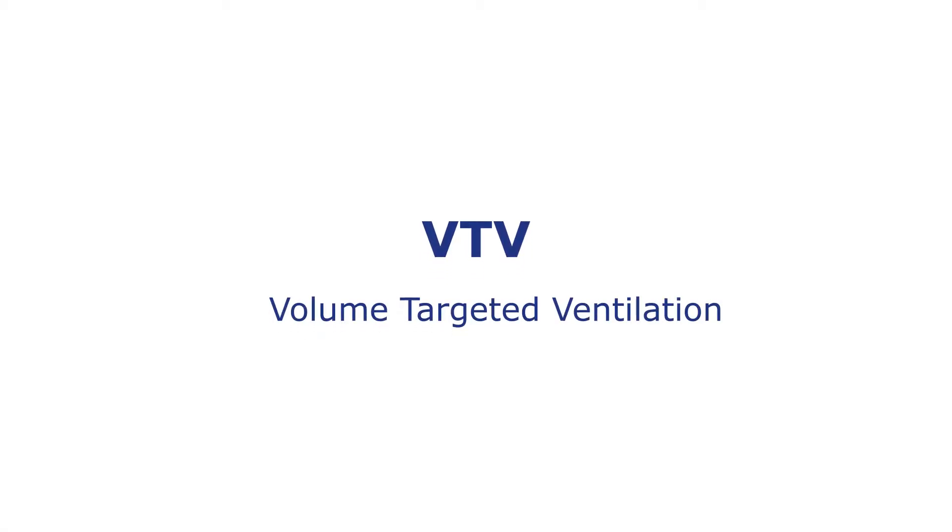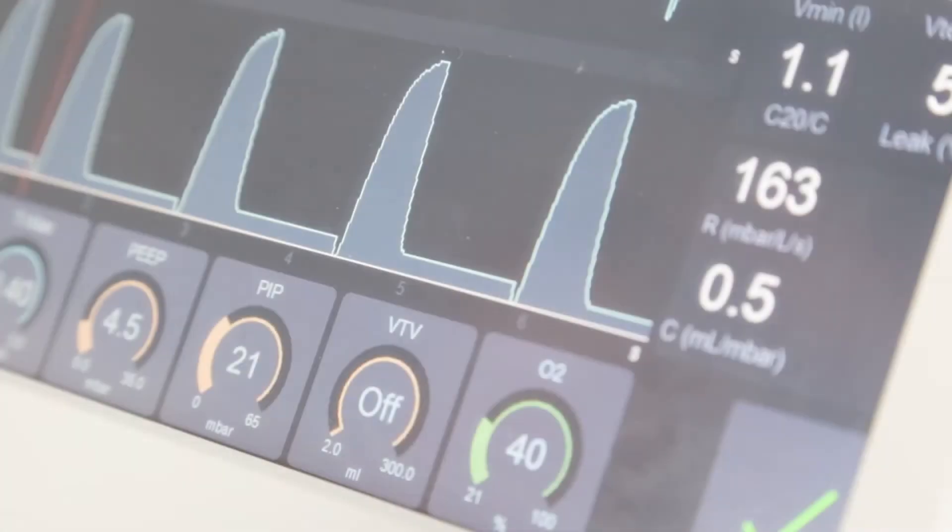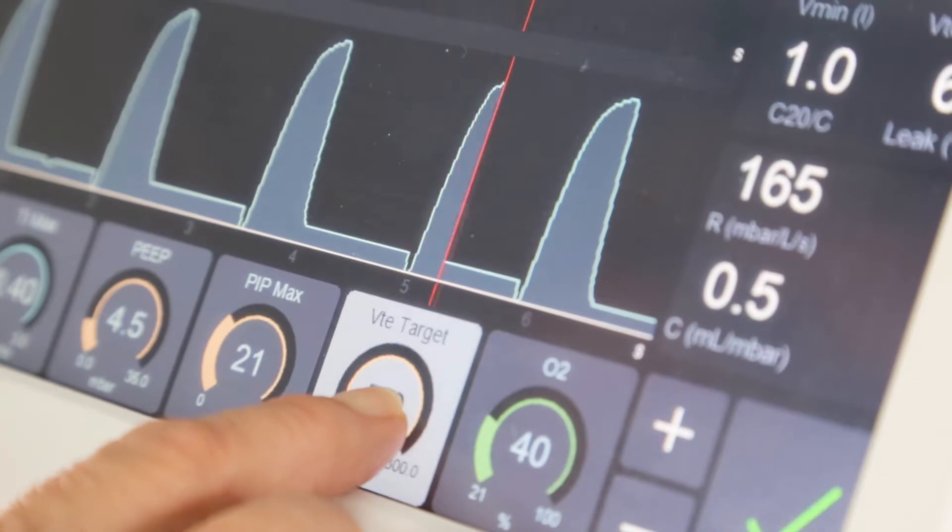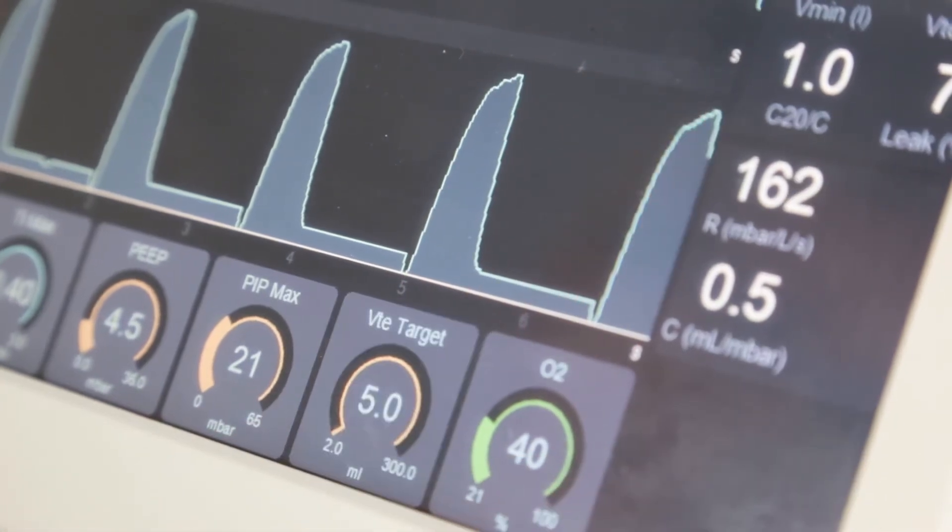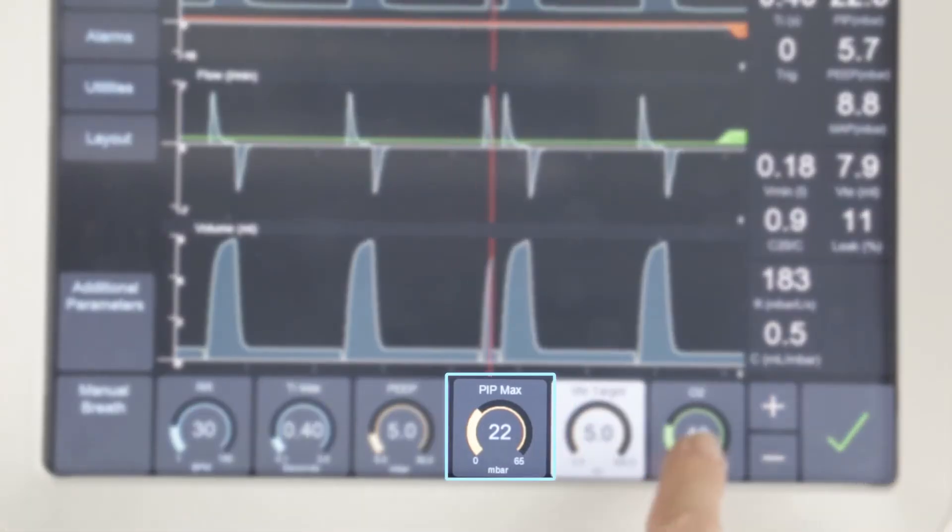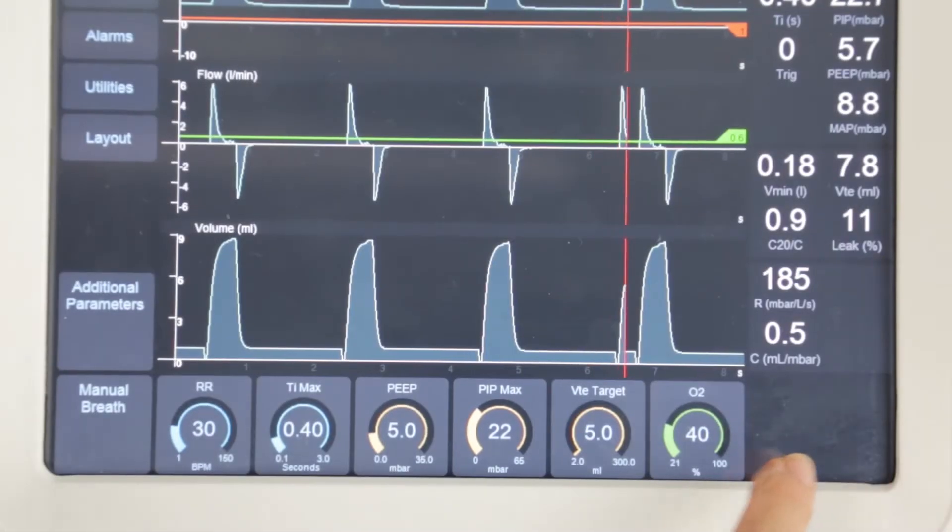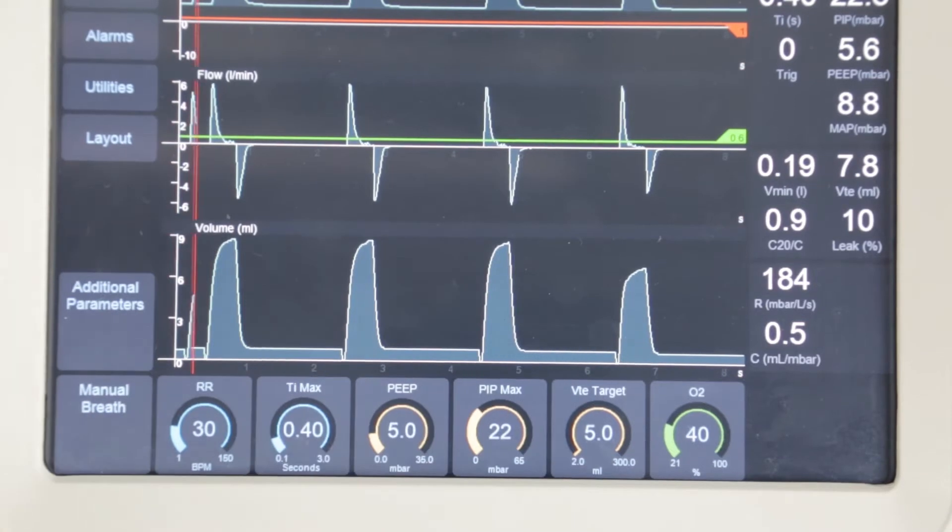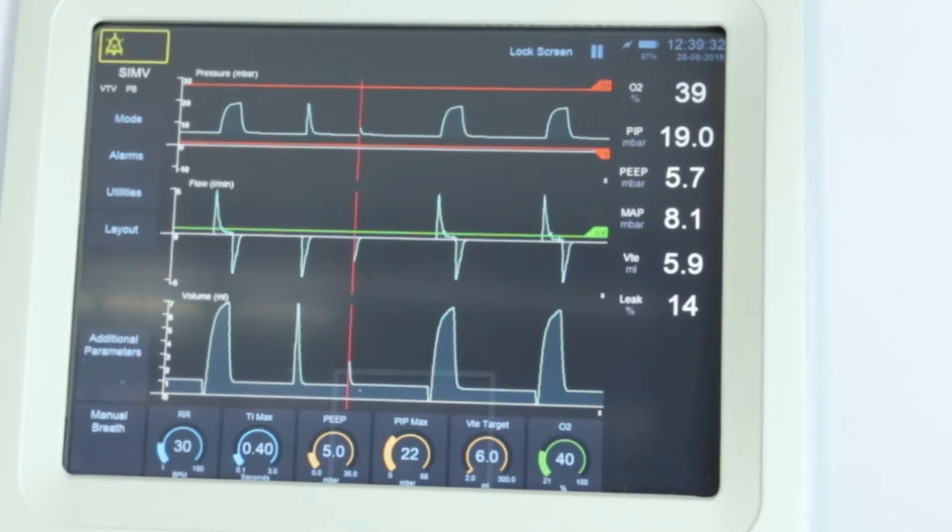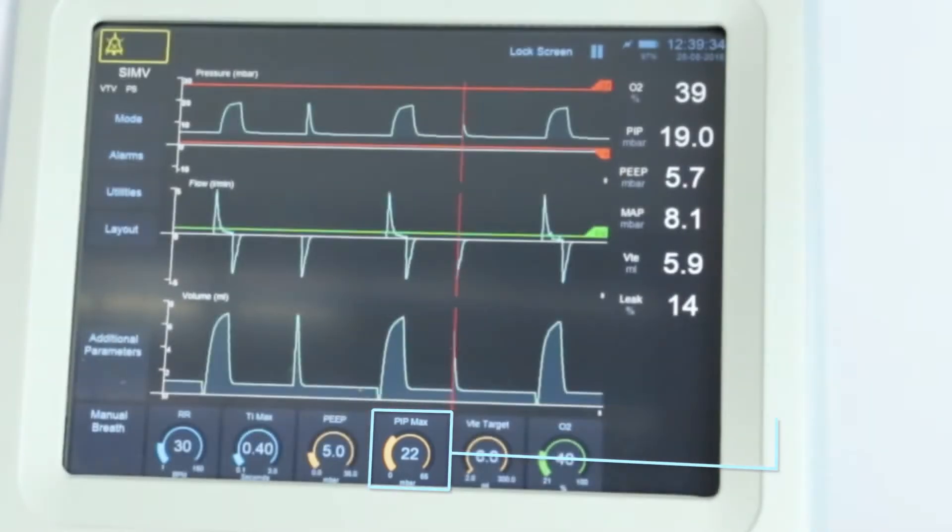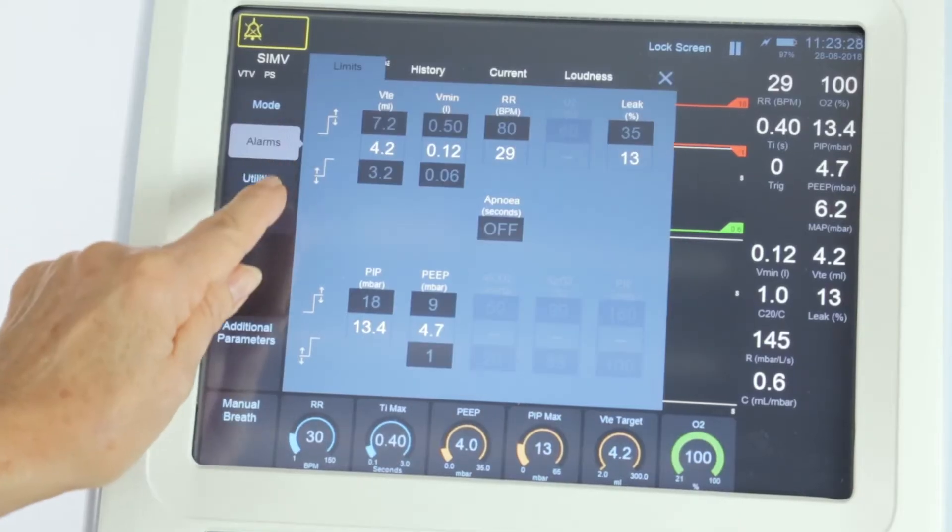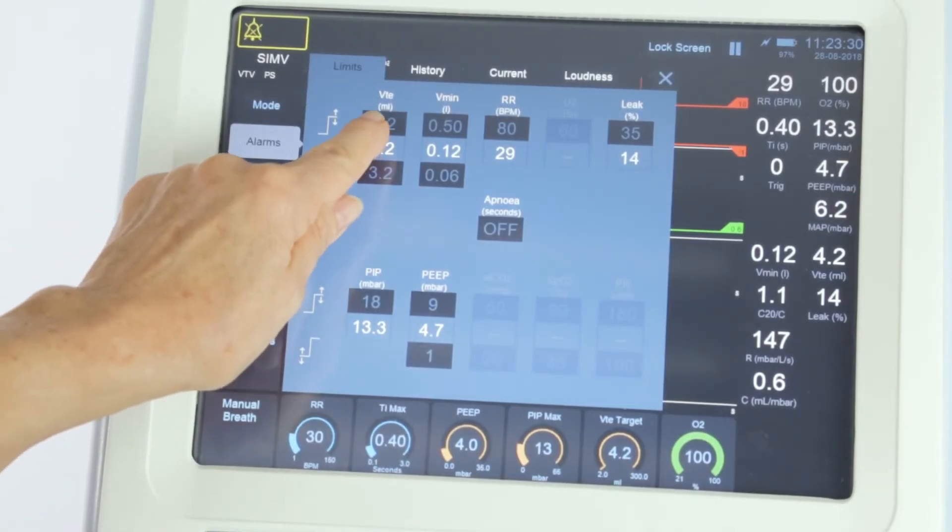Volume-targeted ventilation, VTV. Press and hold the VTV button and select an appropriate tidal volume and confirm. The PIP set originally now becomes the maximum PIP. The measured PIP is the amount of PIP needed to achieve the selected tidal volume. VTV will apply to the mechanical breaths only. The maximum PIP should be set no more than 5 millibar above the actual measured PIP. Set the upper and lower tidal volume alarms.